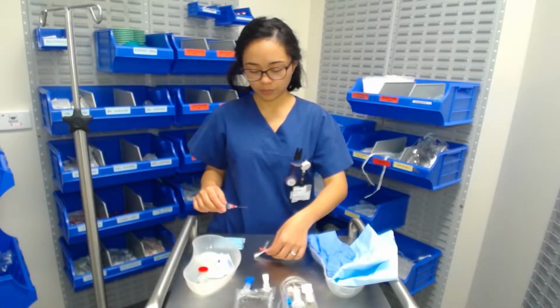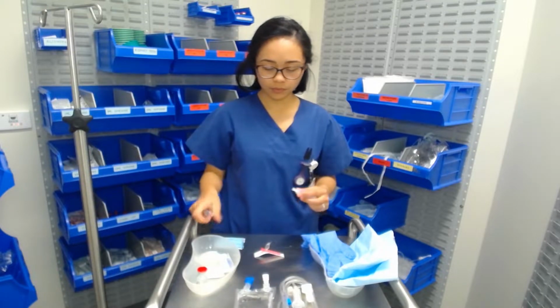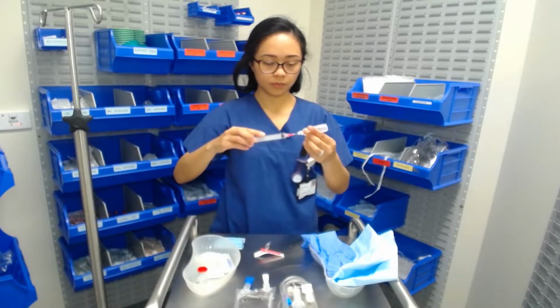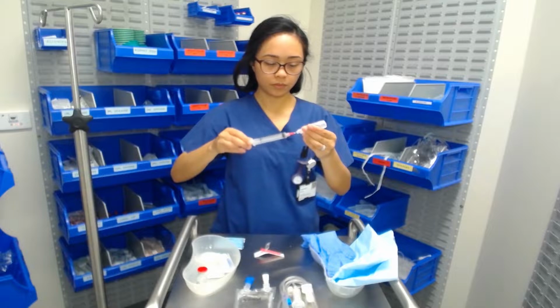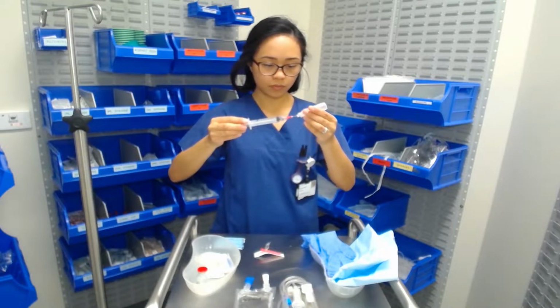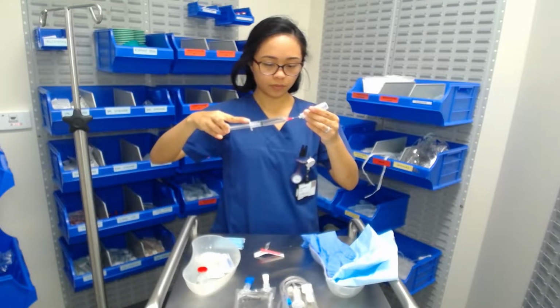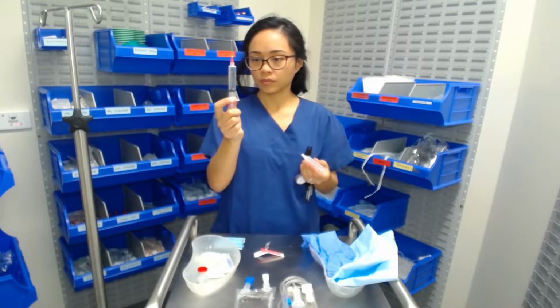So I'm now going to show you the procedure for preparing the injection for eventual injection into the bag of fluid. I'm going to show you a couple of different angles just because I feel as though that might help a little bit more. So right now I've attached a blunt drawing up needle, which again is optional, depends on your hospital policy.